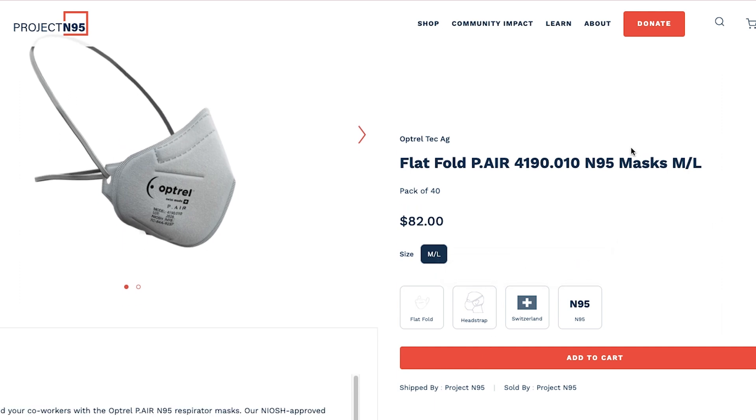You get a pack of 20 for $82, which is a little bit on the more expensive side. So let's go ahead and look at these respirators before we test them on our TSI machine.